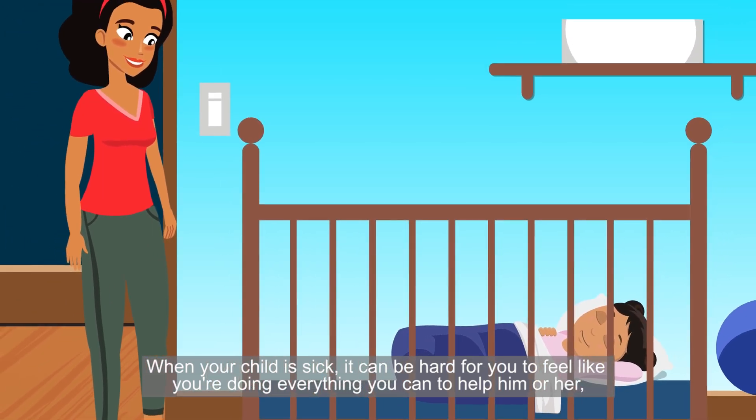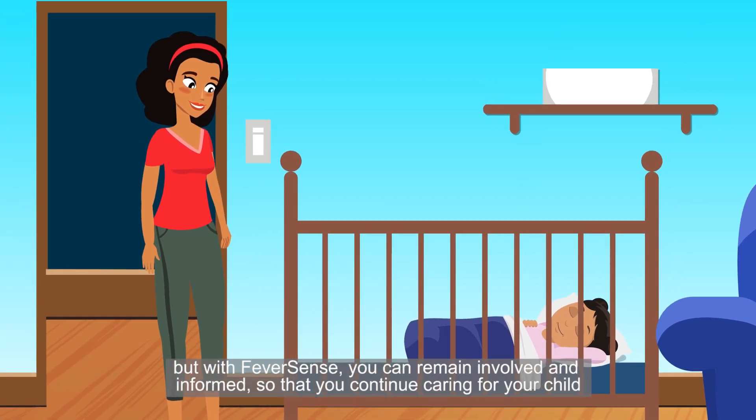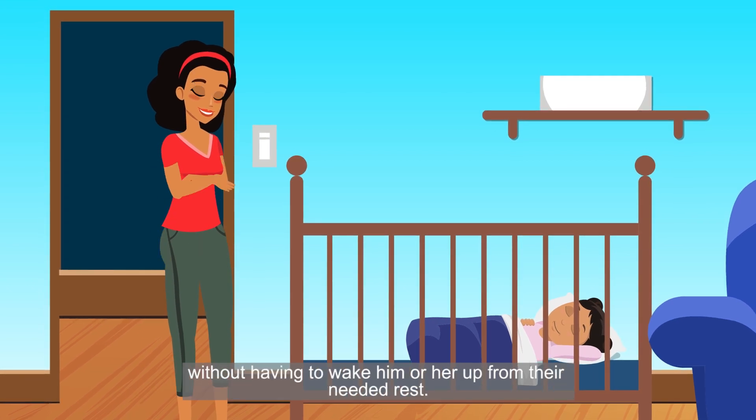Everyone in your family can rest easier, as FeverSense automatically alerts mom or dad to any important changes in their child's temperature. When your child is sick, it can be hard for you to feel like you're doing everything you can to help him or her. But with FeverSense, you can remain involved and informed, so that you continue caring for your child without having to wake him or her up from their needed rest.